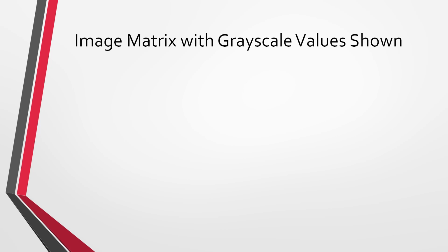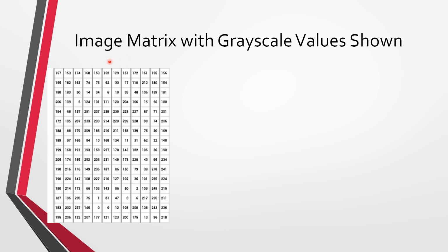So now that we learned about matrices and how values are assigned to a cell in a matrix, let's go ahead and see an example. Here we have a matrix that has 12 columns by 16 rows. So this is a 12 by 16 matrix. This would be pretty low res compared to 1920 by 1080, right?